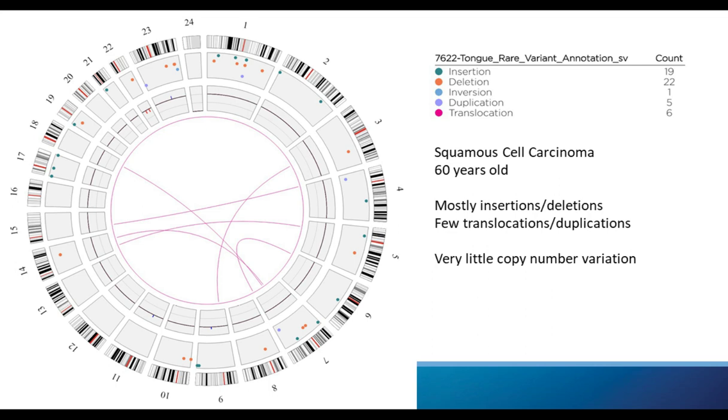Here's the first tongue cancer I'm showing. This is an elderly patient, so 60 years old, squamous cell carcinoma. And this is mostly insertions deletions. And first, I'd like to just go over what we see on the left image here.